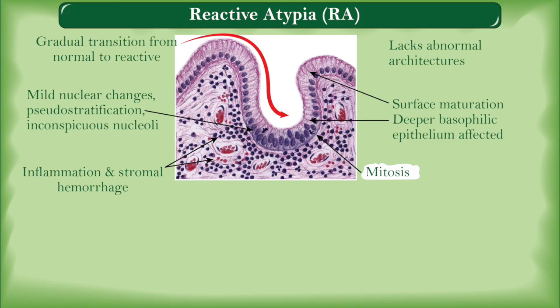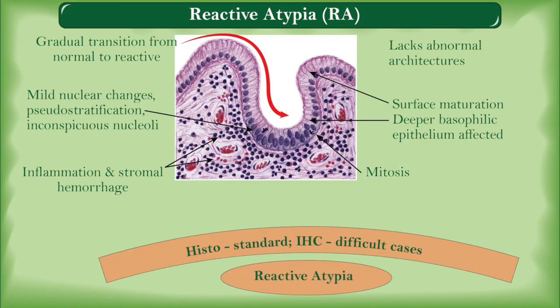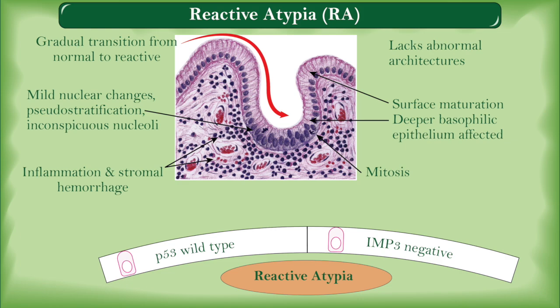Mitotic activity may be brisk. Although histomorphology remains the standard, in difficult cases a wild-type P53 stain in conjunction with negative IMP3 staining may support a diagnosis of reactive atypia over dysplasia.